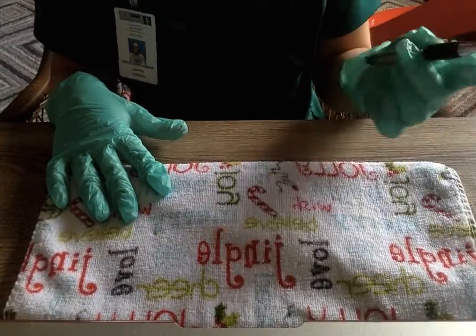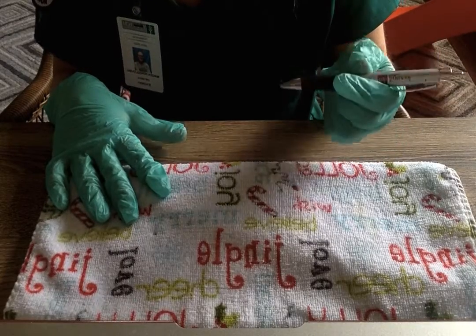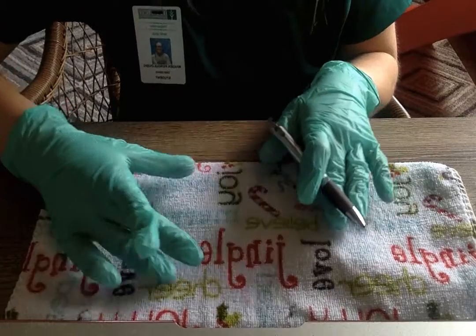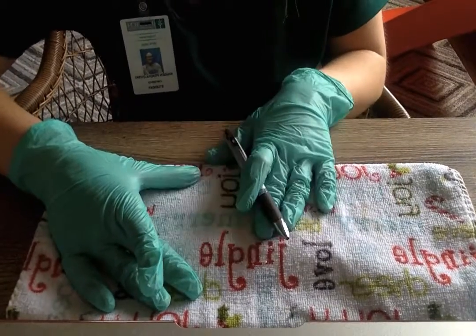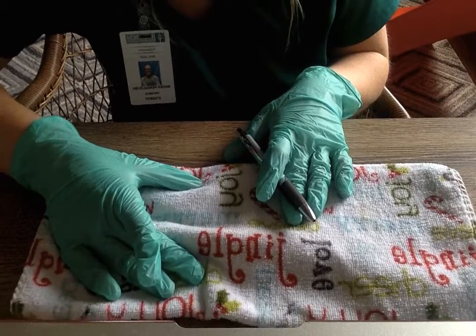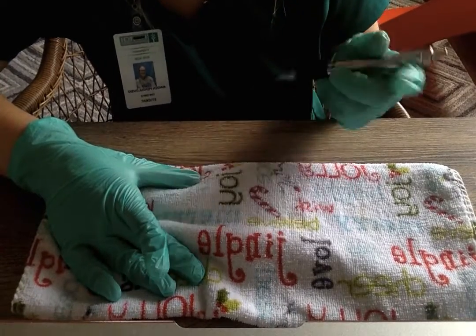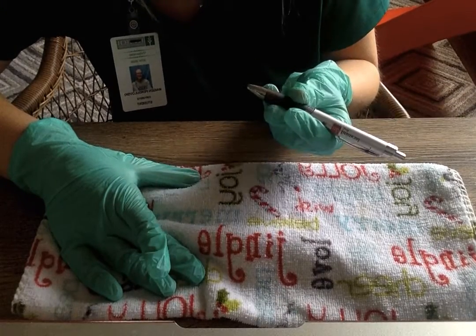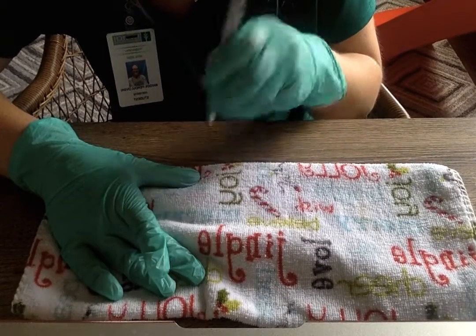So I have my insulin here ready, 6 units for 249 blood glucose level. So I am going to go ahead and have my patient lay down. Everything's okay. I'm going to pinch about 2 inches of skin like so, and depending on the size of your patient, you want to go from a 45 to a 90 degree angle.